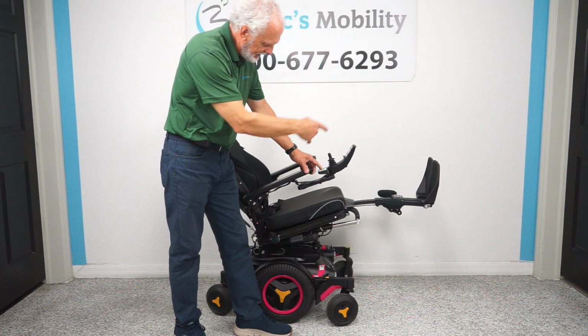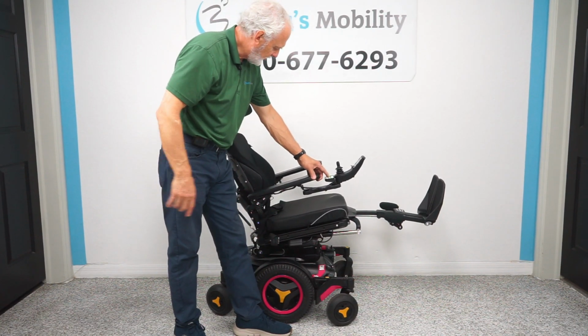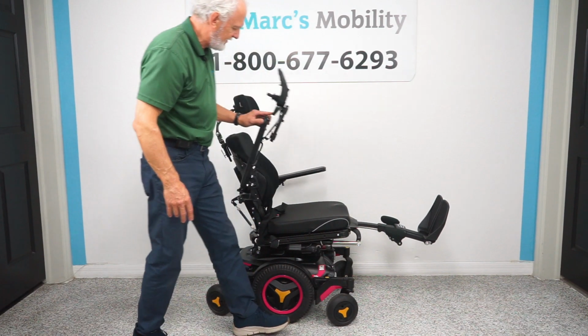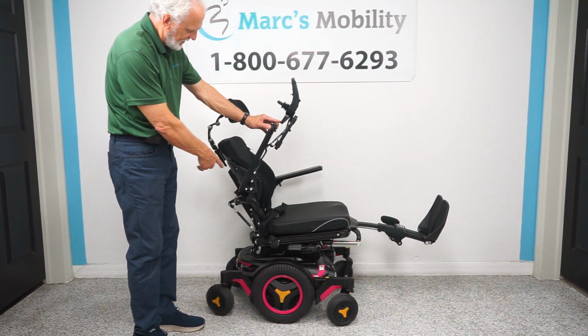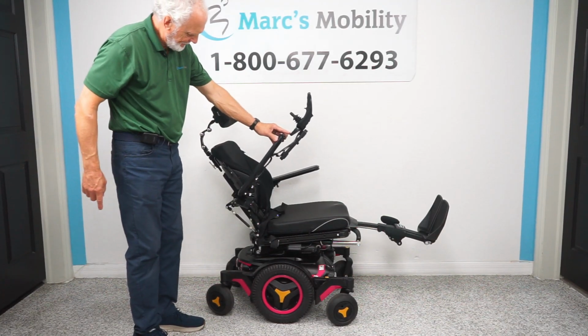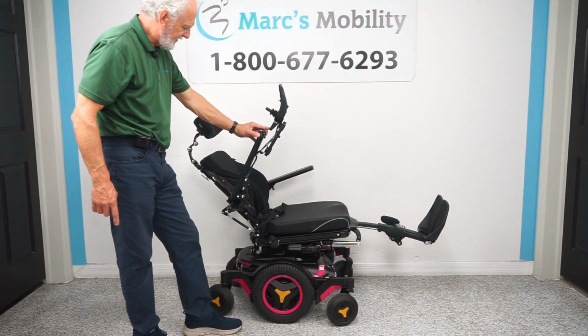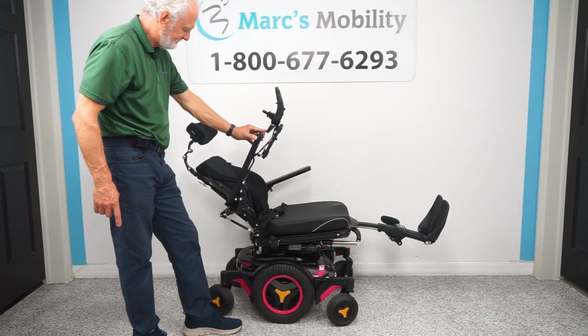So if you've seen the legs and you've seen the tilt, the only one left now is the recline. So the recline is when the back goes back. You can see the back going back by itself. I'm holding the button here with my finger. This is called recline. And we're going to see how far it's going to go.